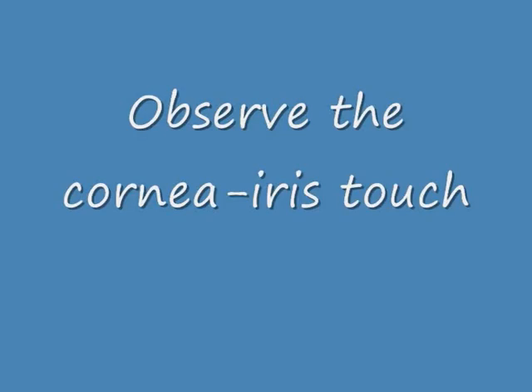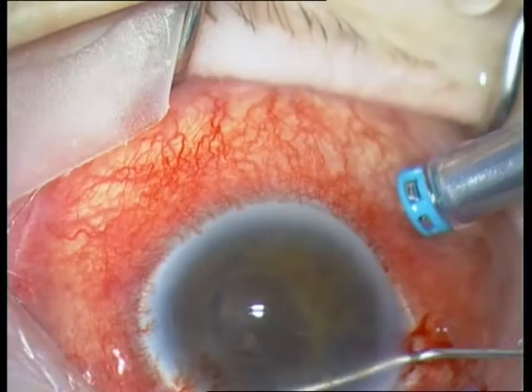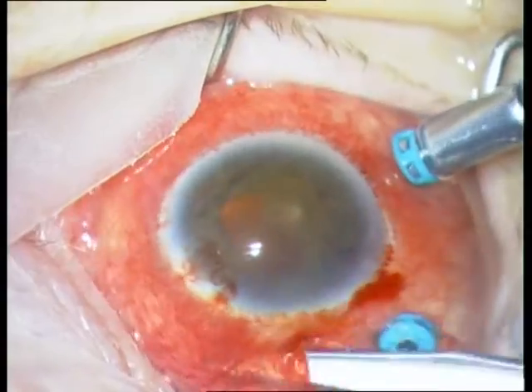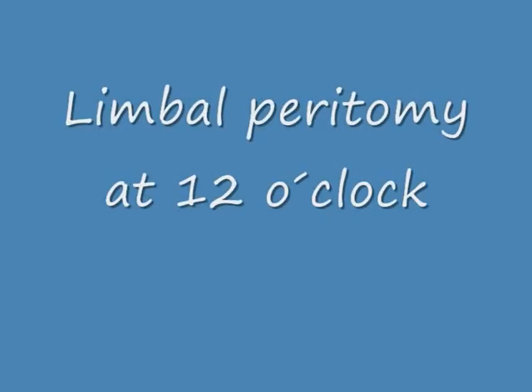Observe the cornea-iris touch. The anterior chamber was completely flat. Now the globe is soft and you have re-established the anterior chamber.